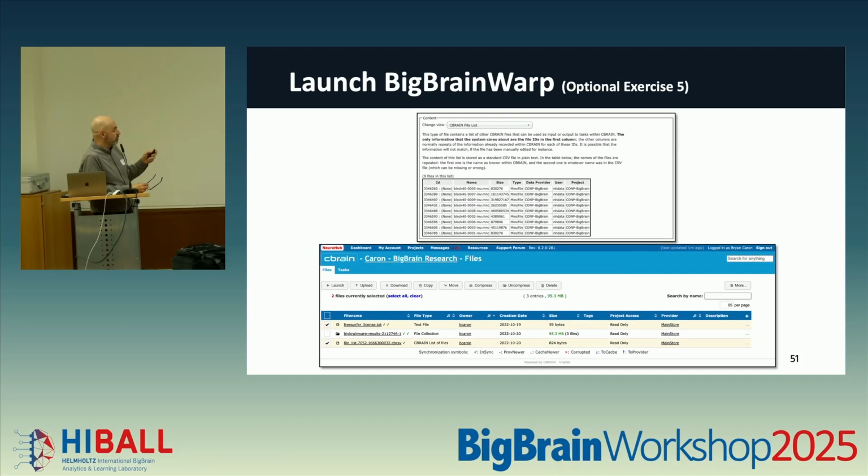So great. So now what you're going to work with, instead of selecting all 9 of those objects and saying, I want to run the task, and doing that 9 different times, CBRAIN has a way, because it's using containers. What we do as a workflow is say, well, I don't want to just run on one file. I want to run it on all the files that are contained in this file list, okay? Therefore, what I'm going to select as the input is the file list itself.